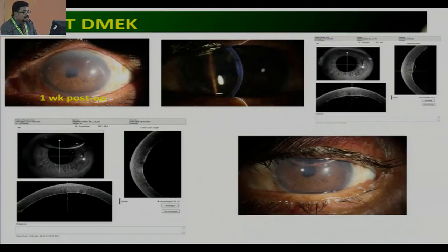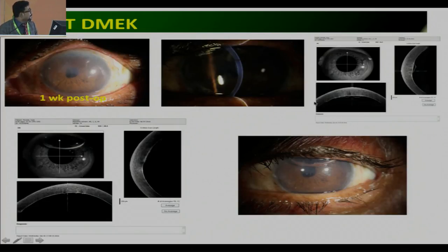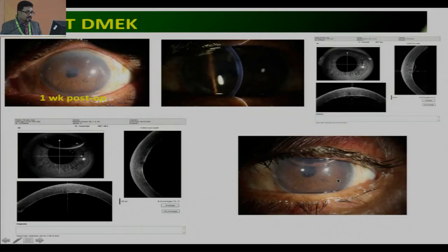OCT in DMEK: a patient at one week post-op had a hazy cornea, and only on OCT could we find slight Descemet's membrane detachment. After rebubbling, we can find the Descemet's membrane detachment is resolved and the membrane is attached.